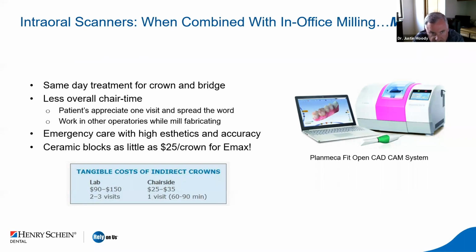and it's going to give you that ability to do same-day treatments for crowns and bridges, especially implants. We don't talk too much about real tooth bridges. I don't do those anymore, but I do make implant bridges. And depending upon the span, many of these machines will often allow you to do that as well.